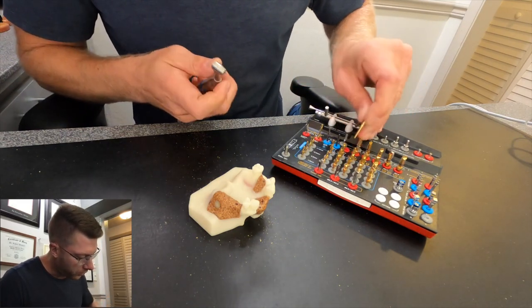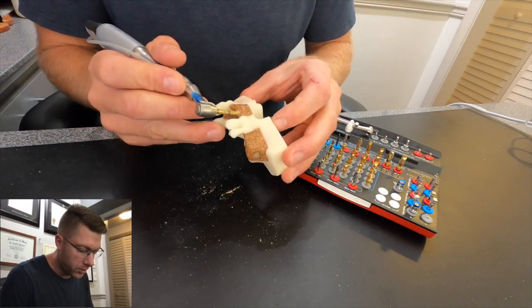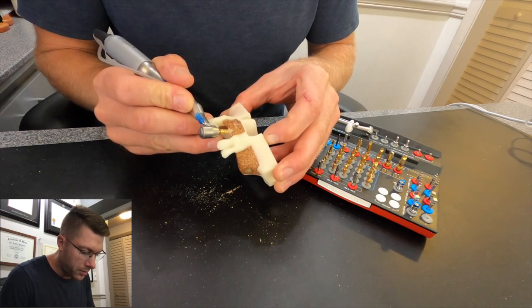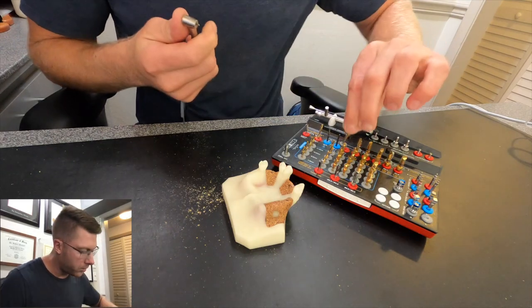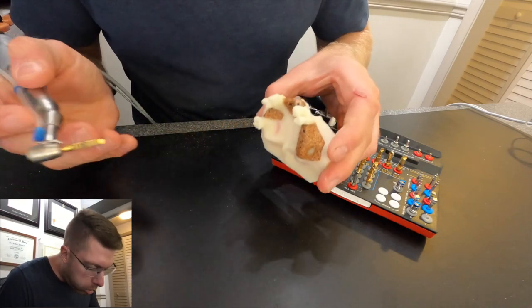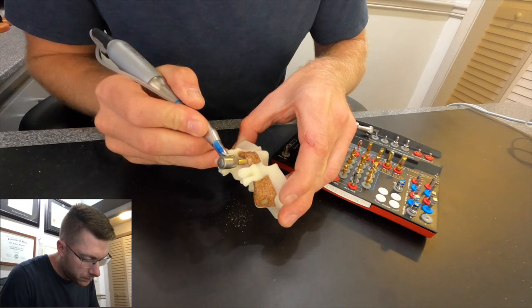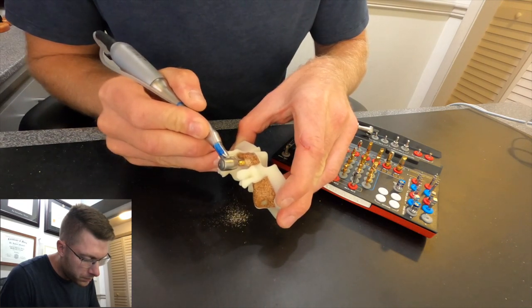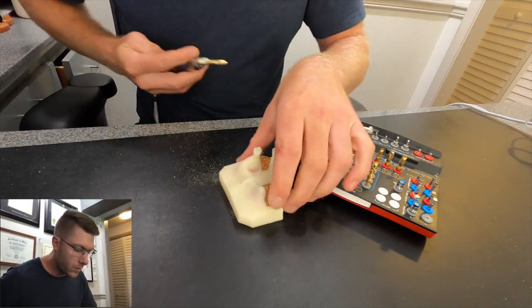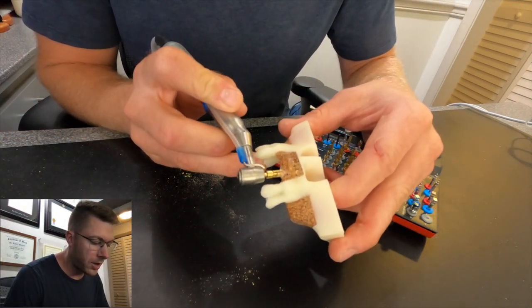All these drills are marked the same. This is my 3.3 — this is going to be my second-to-last drill. Going to go to depth here. And now let's go to our final drill, which is 3.8 millimeters in diameter. We're going to go to depth on this one as well. On the model you can see this drill goes all the way down to the top of the black line.